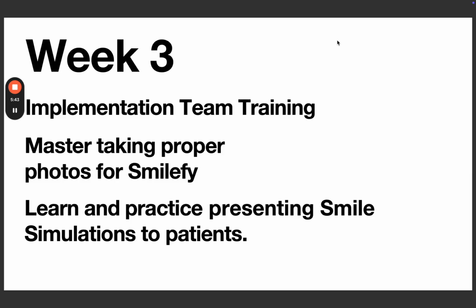So, if you have somebody in your team that is willing to learn the step-by-step process on how to upload the patient files, create a smile simulation, and export the patient's data, including the 3D design, then this training is for you.